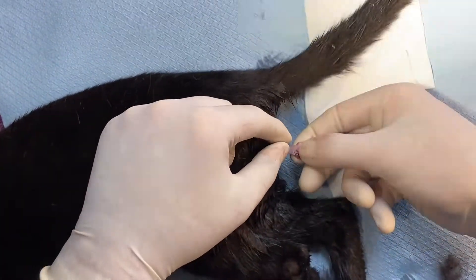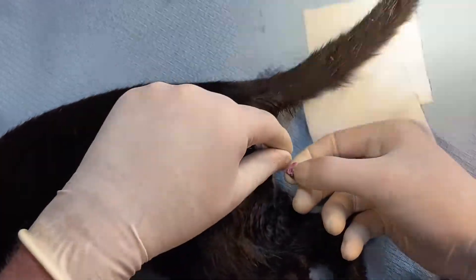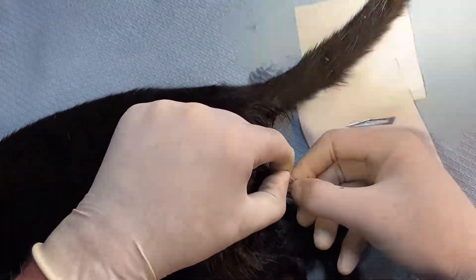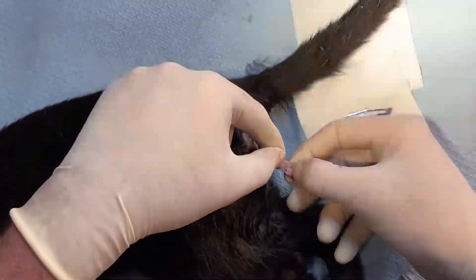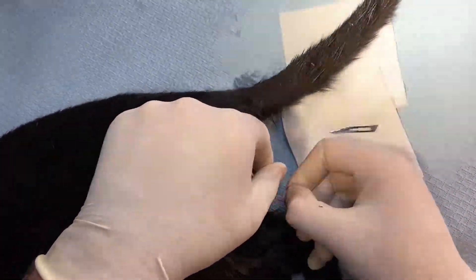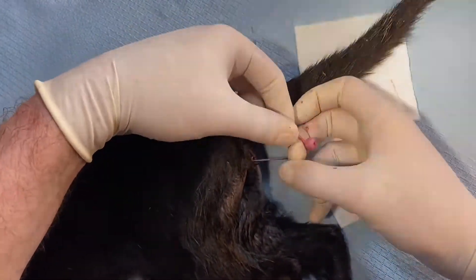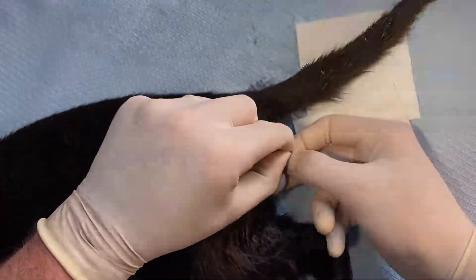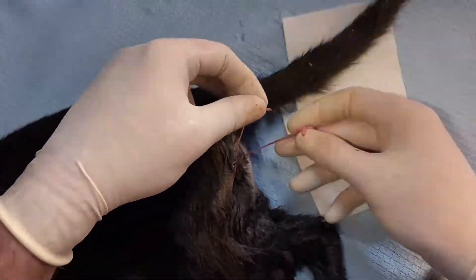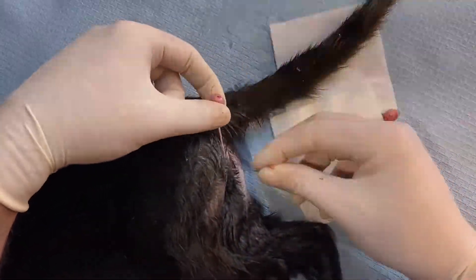Now you can see the vessel and the attachment. We take away the attachment from the epididymis, and now we've got the cord and vessel which we separate. Then we just use the cord and vessel to do our ties.